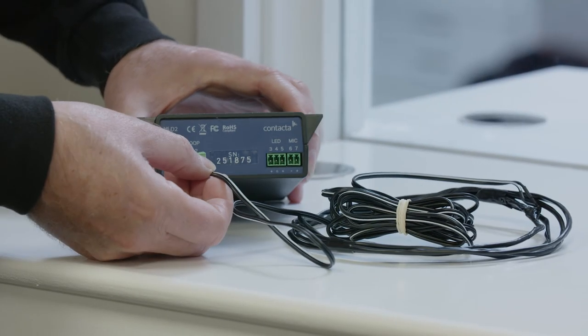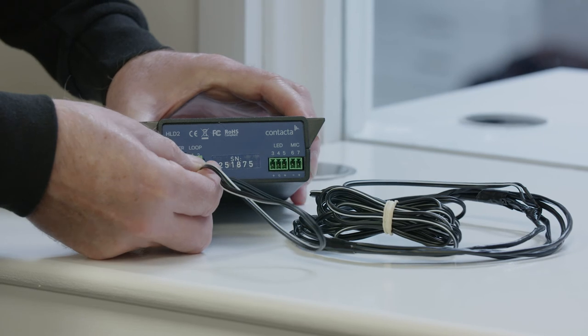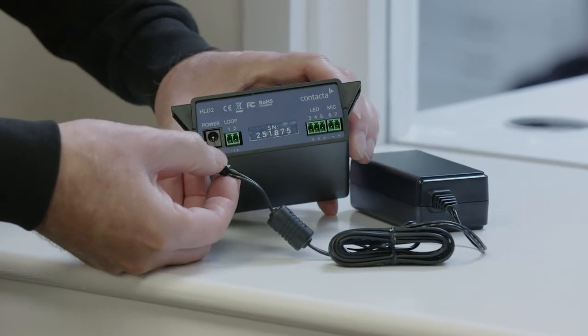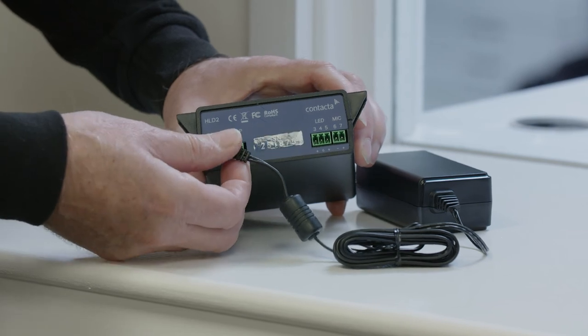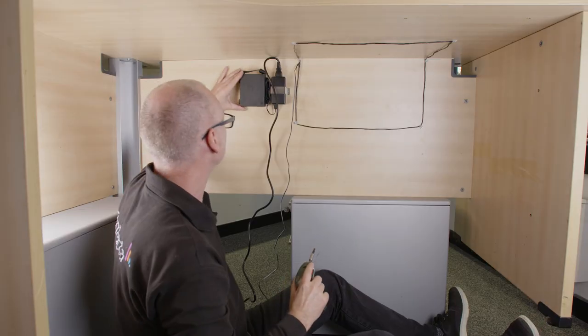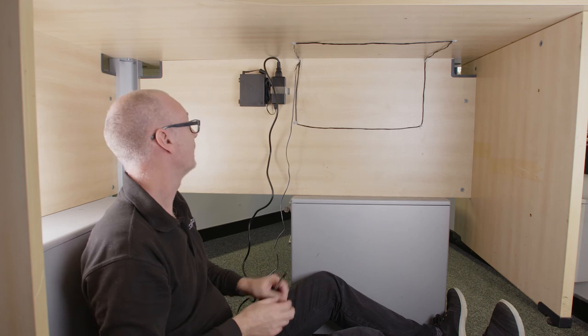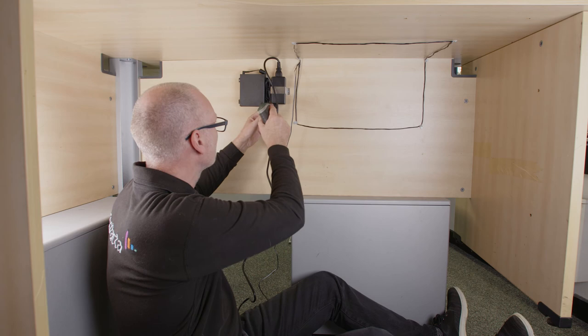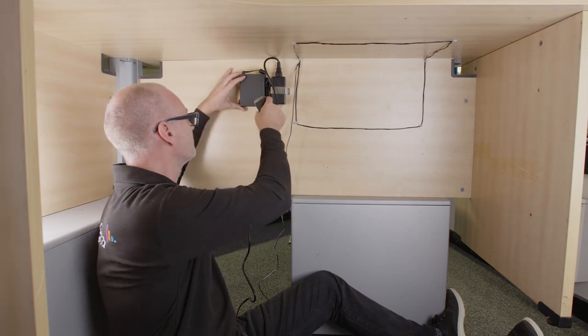Connect the hearing loop plug into the loop sockets labeled 1 and 2 at the rear of the HLD2 driver. Now connect the power connector to the far left socket labeled power. Mark the four fixing points for the driver under the counter, then drill and fix the driver in place using the supplied screws. Ensure access to the rear panel for necessary connections.